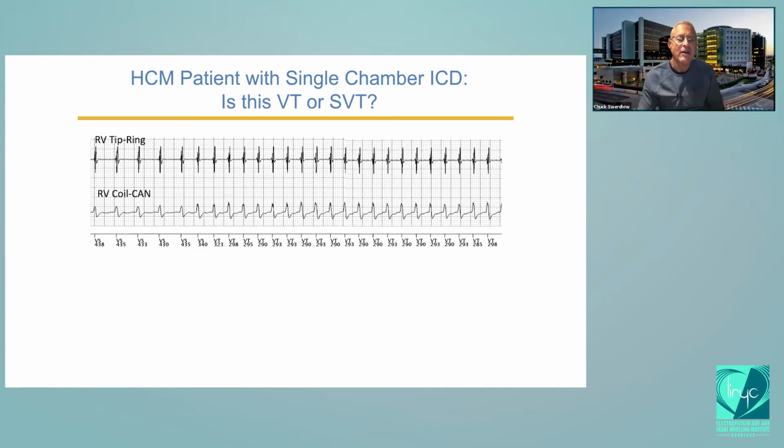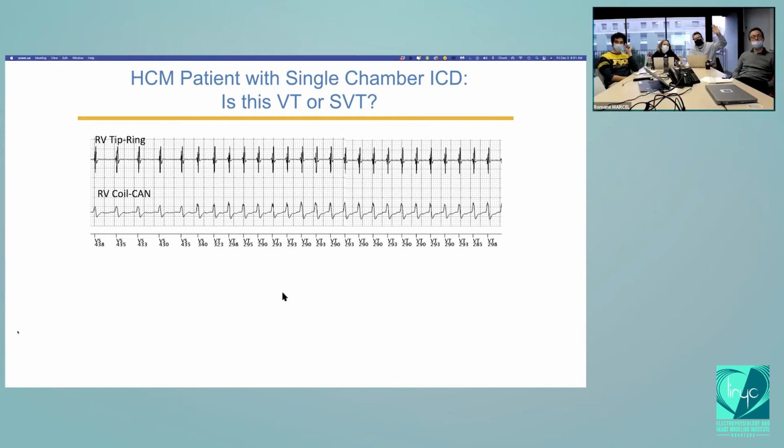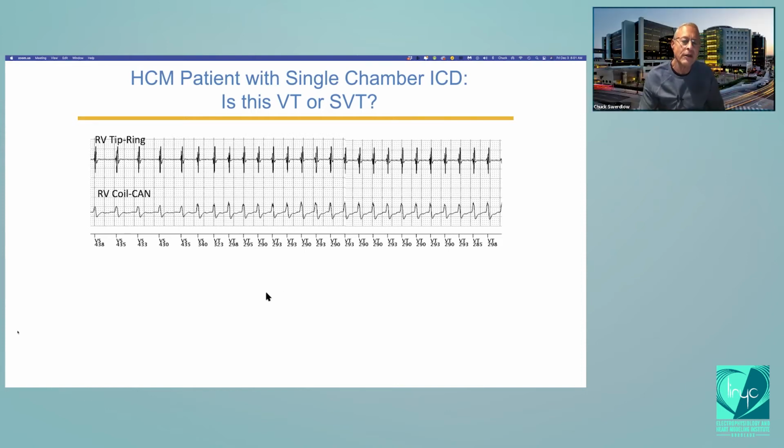Yes, and you have identified all the key characteristics of this slide. Daniel, good. So Dan, you've identified all the key characteristics here. Now if I really push you and ask what's different about the shape in sinus rhythm versus tachycardia, what's really different is the amplitude.